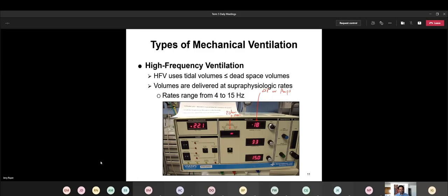And you'll make adjustments as you need to, so that it's not too far off. But this is not too far away from 20, so that's why I just used the number 20 as an example. How you're achieving your amps is this knob right here. It's called the power. It says power, and that's all it really says. And the numbers on here don't really mean anything. They're there, but you're not going to document it, because you're just going to adjust this knob until you get your delta P to be what you're trying to get.